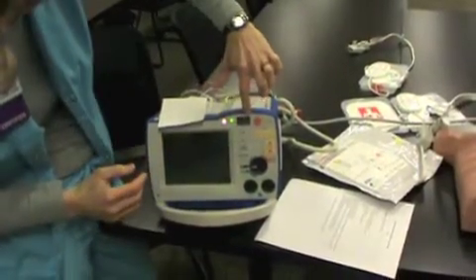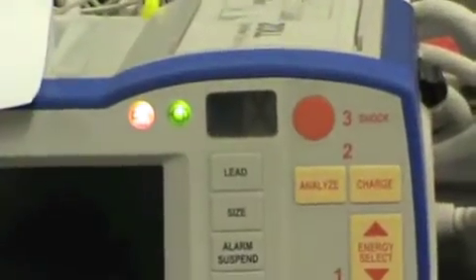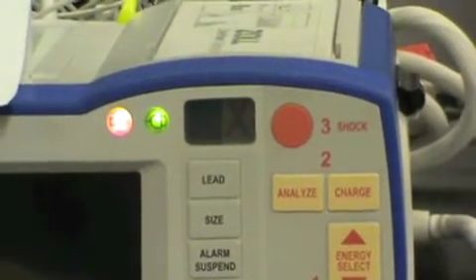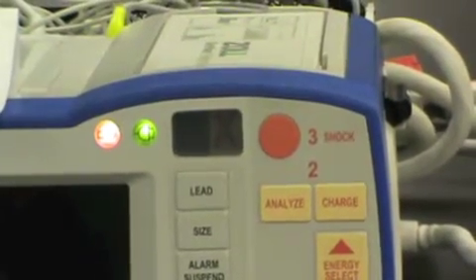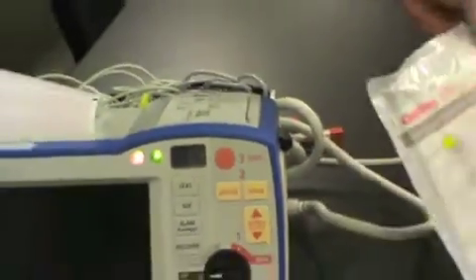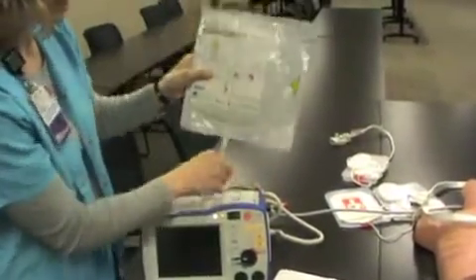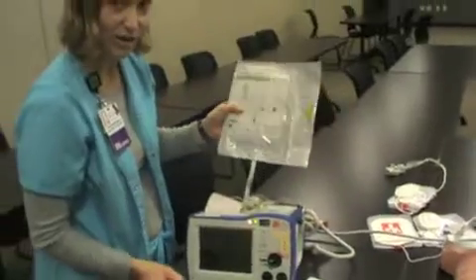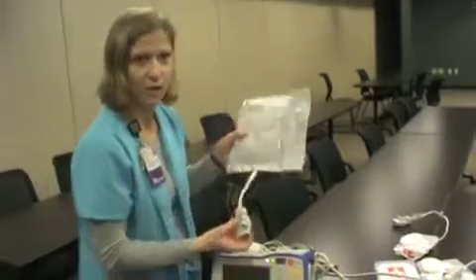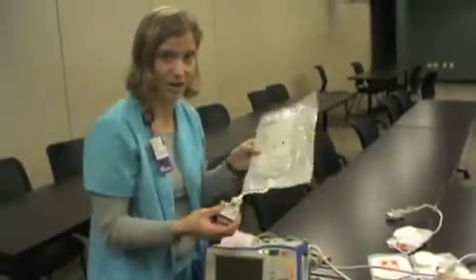Also right here on the front, you'll see this red X. So this is a very smart machine, and every morning at 3 o'clock in the morning, it will silently wake up and run through over 100 self-checks. One of those checks involves the pads, which are supposed to be continuously plugged into the machine. It will check the expiration date on the pads for you, and it'll let you know in the morning if it didn't pass that check.